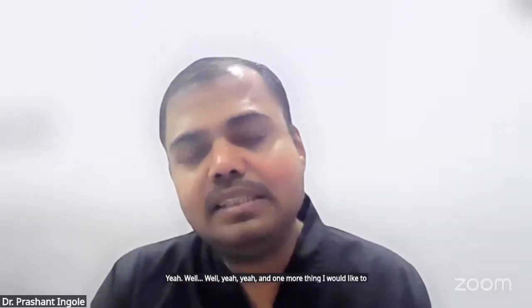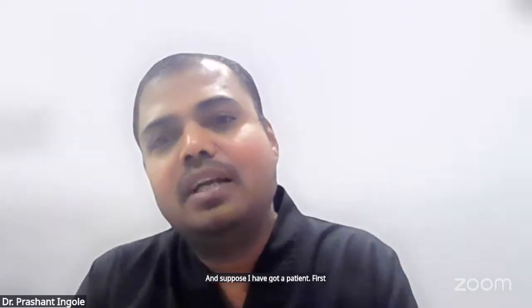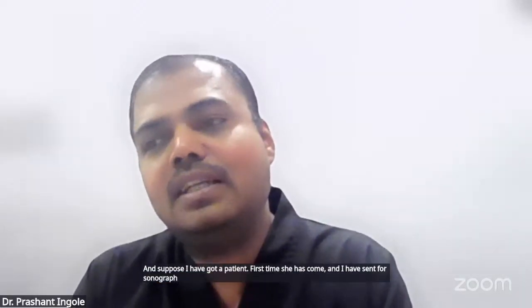One more thing I would like to say is that as the gestation increases, the cervical length also shortens. So 25 is the fifth centile at 24 weeks. Suppose I have a patient who has come for the first time, and I have sent her for sonography and they say that the cervical length is 2 centimeters at 32 weeks.